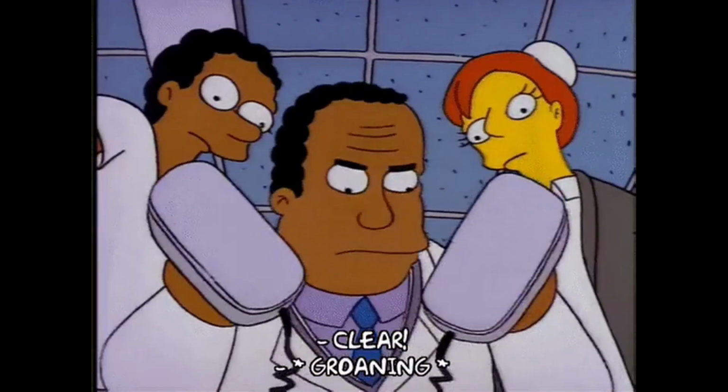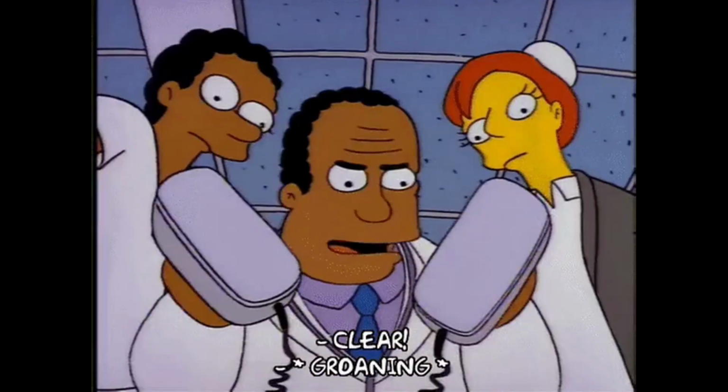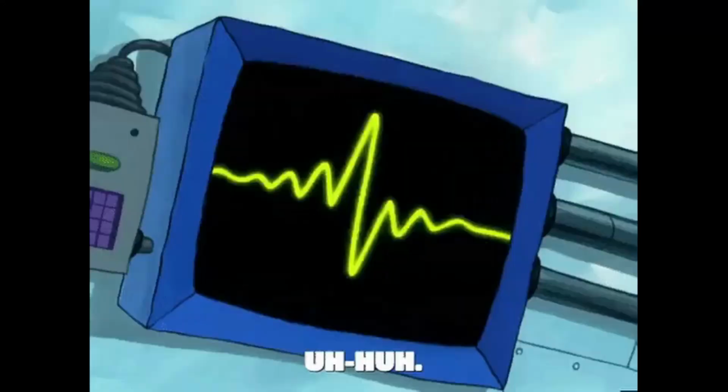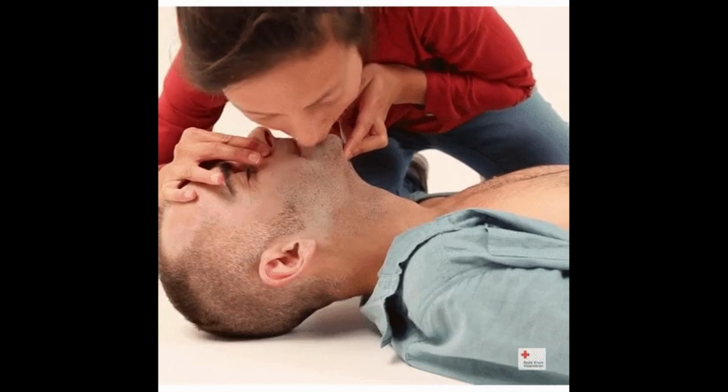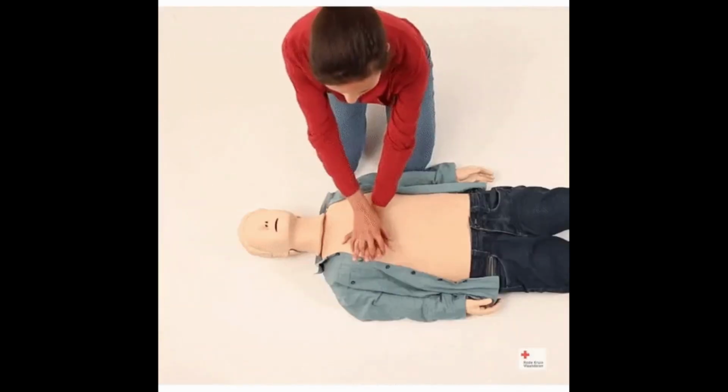It will begin to analyze the heart rhythm of the victim. The automated external defibrillator will then tell you if a shock is needed or if you need to keep doing CPR. If no shock is needed, this means that the victim has regained the pulse or has an unshockable heart rhythm. If there is no shock advised, you need to continue CPR until emergency workers arrive.